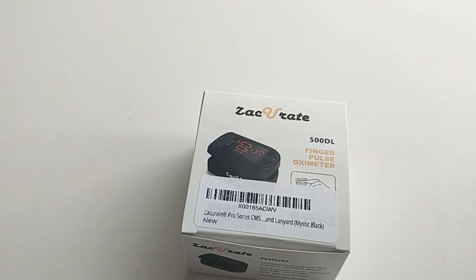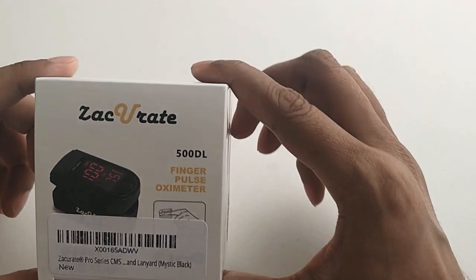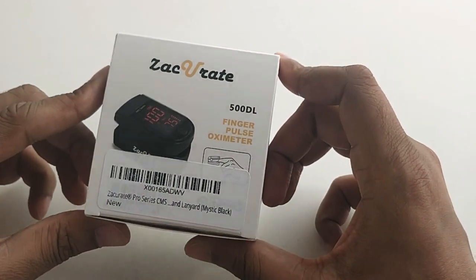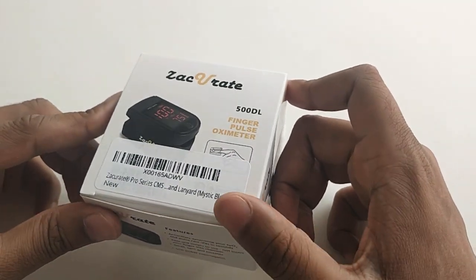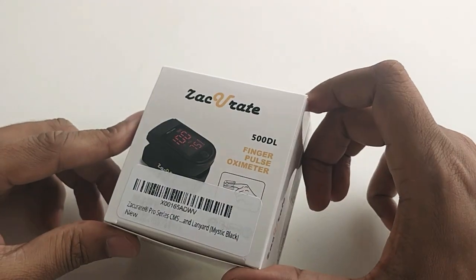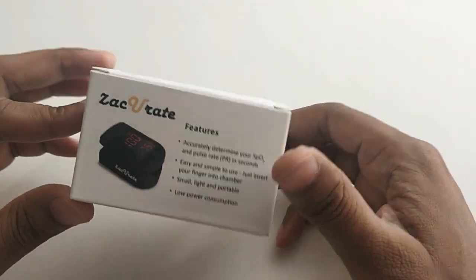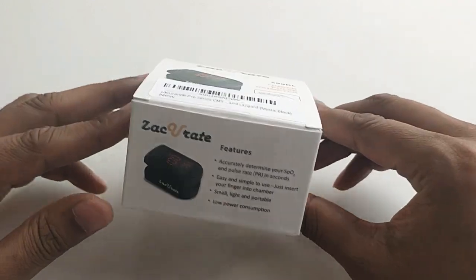Hello everyone, welcome to Fun Infinity video. Today I'm going to talk about the Z-Decorate oximeter which I bought yesterday, and I wanted to share my experience and why I bought it and why you should also have this device at your home. I bought it to check my oxygen level in my body.